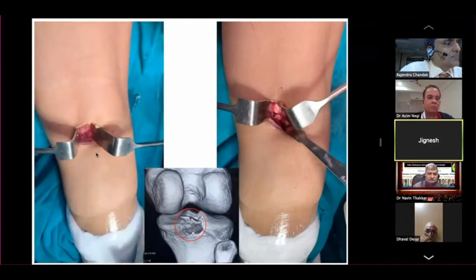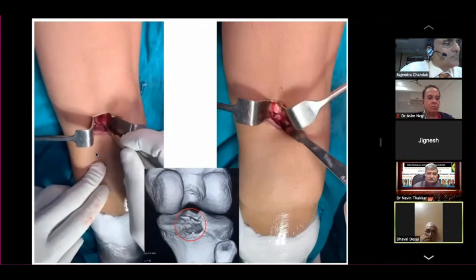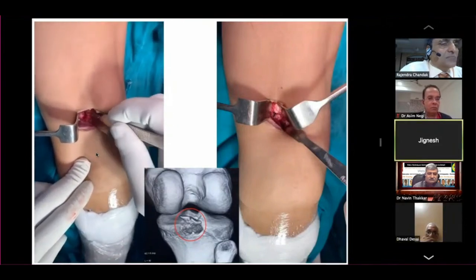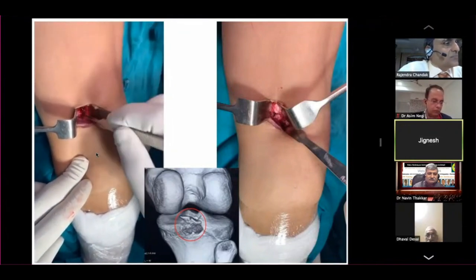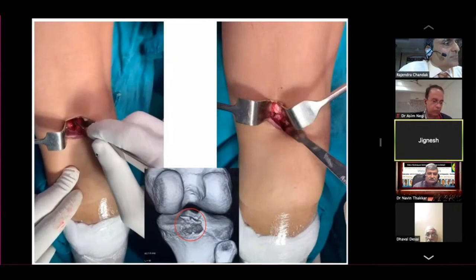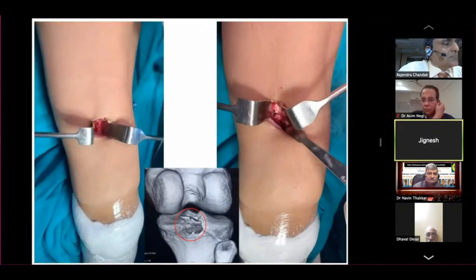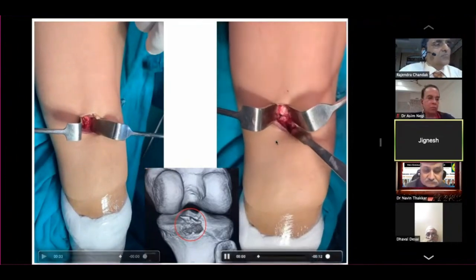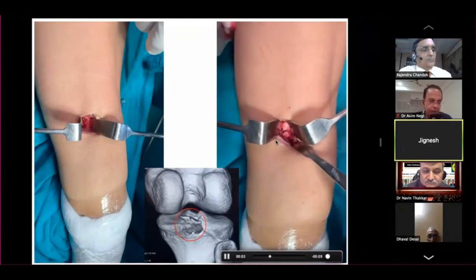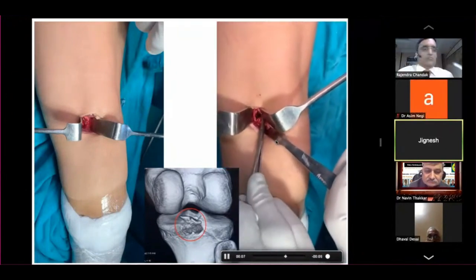In the center you can see the picture. Now I will cut directly on the fragment through the popliteal fascia with the knife. No blood here because everything will be easily identified and can be retracted nicely. Fascia is cut and we can see the fragment. Once the fascia is cut, use the suction — the blood will be sucked and you can elevate the fragment in front of your eyes with the artery forceps.